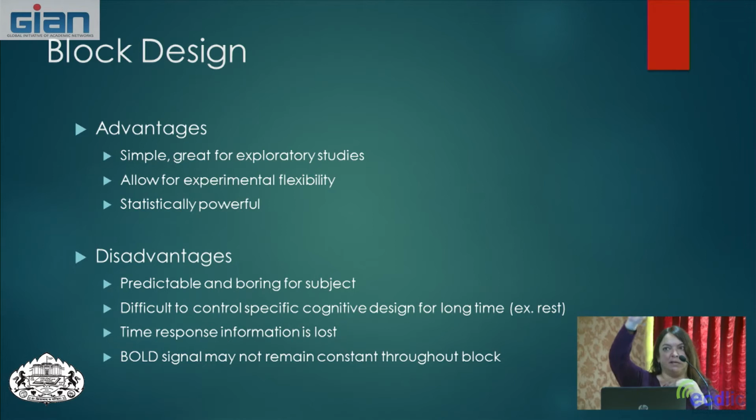It's coming up and it's staying up throughout the whole period that we're having them do something, and then it's falling again. Another thing is that we're assuming when we do this that the BOLD signal is remaining constant throughout that block of time when it may actually not be. So those are some of the disadvantages of a block design.